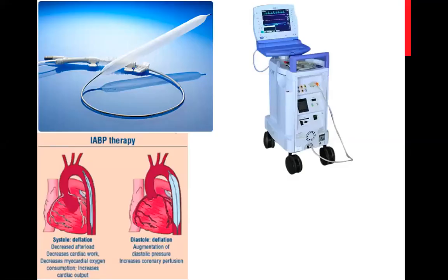The intra-aortic balloon pump has two main parts, the console itself and the catheter with the balloon. The gas usually used to inflate it is helium. A long time ago, they used CO2, as it has more diffusion and less risk of air embolism. But helium is used now most often because it's lighter weight in deflation and inflation. I believe it inflates and deflates much more smoothly.